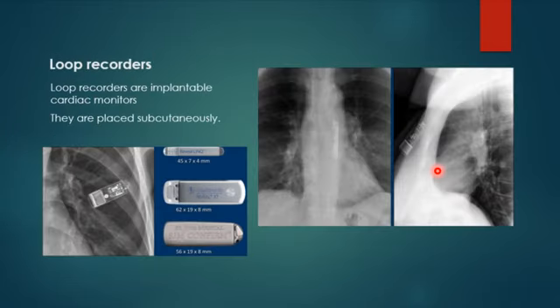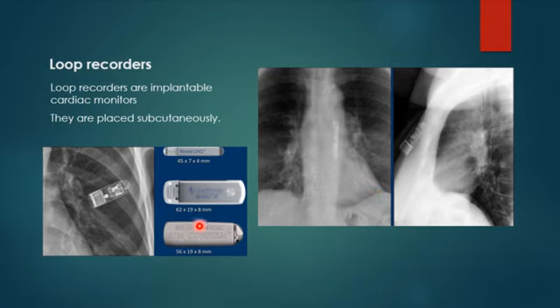There is a device called a loop recorder. It is implanted under the skin and is responsible for recording the cardiac rhythm in patients with unexplained palpitations and syncope. On imaging it appears very small, seen on both PA and lateral views as a subcutaneous device that transmits ECG data, possibly via Bluetooth.